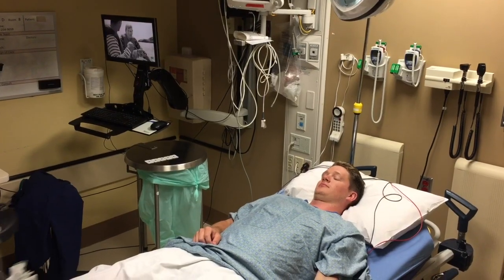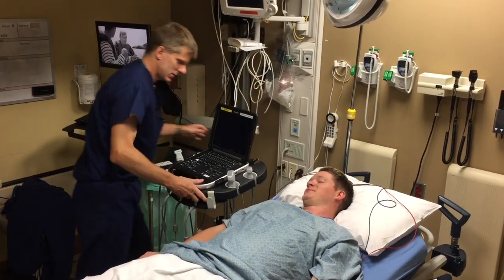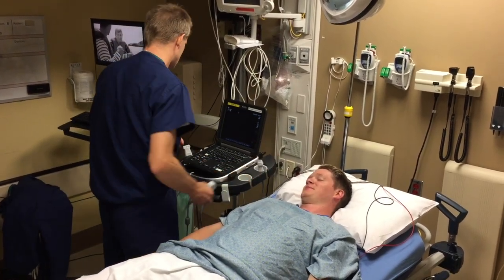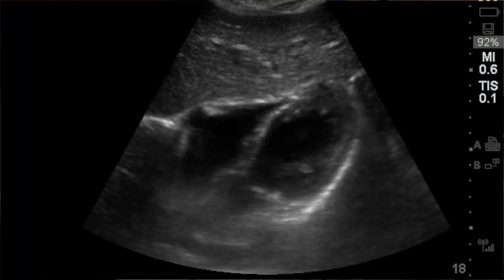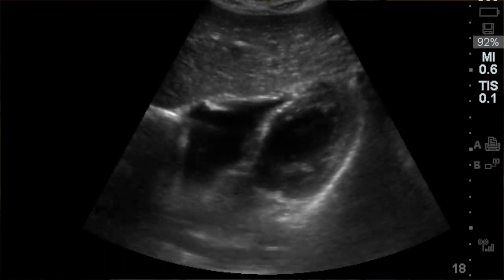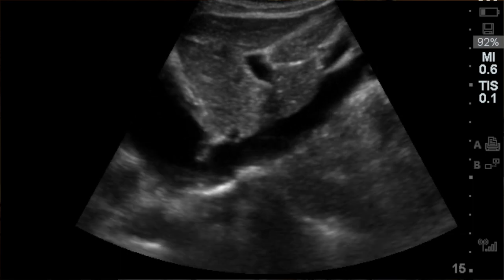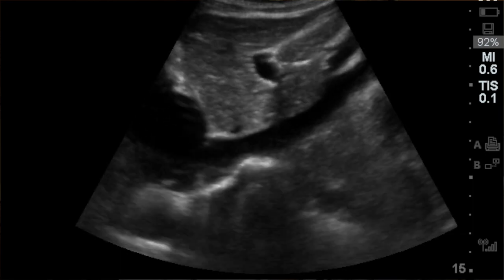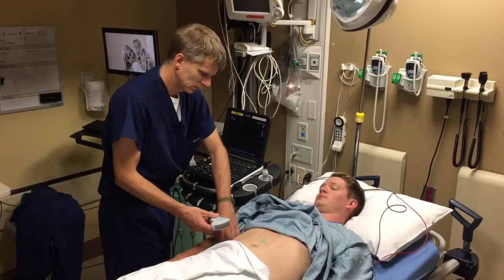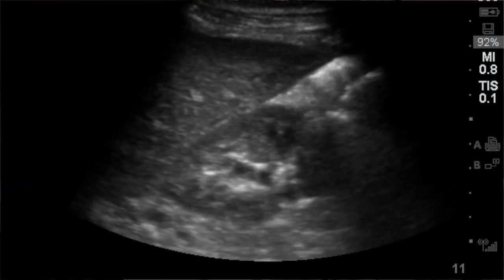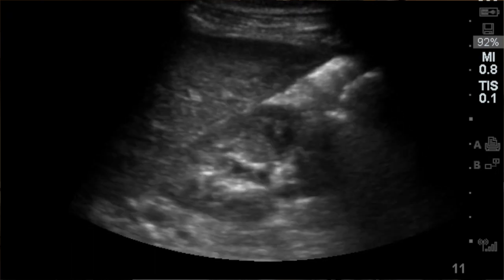Hey there, I'm Dr. Pizodi. No English — okay, let's see if the ultrasound helps us here. Start with the heart: squeezing pretty good, that's definitely not the problem. IVC: normal collapsibility. Move over to Morrison's: no fluid in Morrison's, looks good. Aorta: seems pretty unlikely in this young guy, but we'll take a look anyway — running down the aorta, it's a pretty normal looking aorta all the way to the bifurcation.